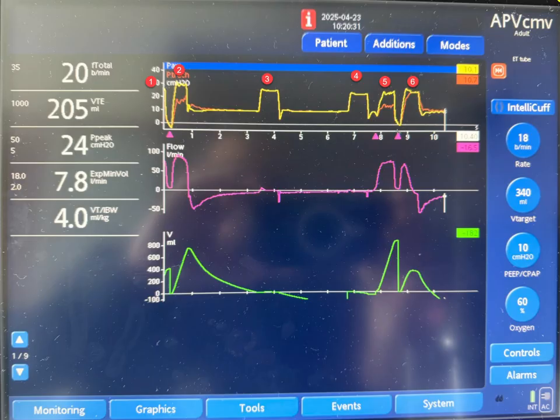And then the patient triggered the ventilator again. So there's a possibility the patient continued his inspiratory effort here. Inspiratory time finished here, so that's why we released the pressure, but the patient's inspiratory effort did not end yet, and he triggered the ventilator one more time, resulting in this pressure, that resulted in this inspiratory flow, and that resulted in this tidal volume. So what we have here is a double triggered breath. It's only one inspiratory effort by the patient and two mechanically delivered breaths with the same pressure that was used in the previous breaths here.